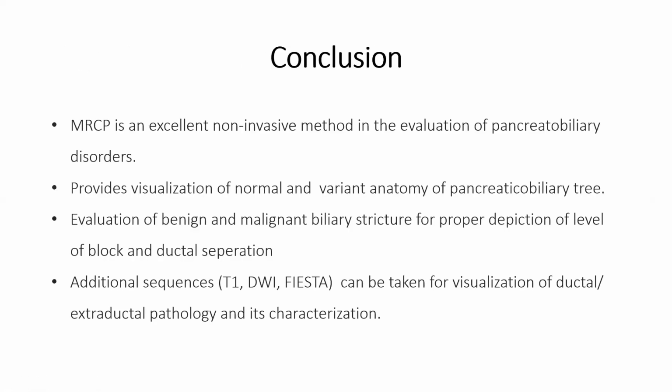So in conclusion, MRCP is an excellent non-invasive method for evaluation of the pancreatic biliary disorders, and it provides visualization of the normal and variant anatomy of the pancreatic biliary tree. It helps for evaluation of benign and malignant biliary strictures for proper depiction of the level of block and ductal separation, and additional sequences like T1, DWI, FIESTA can help for better characterization of these lesions. Thank you.